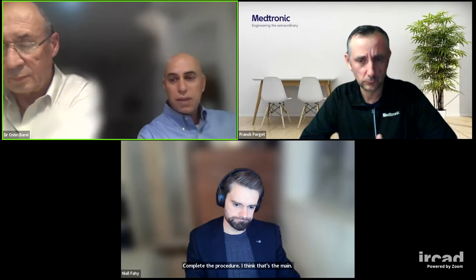And I can say that in hysteroscopy, if you want to take a look at the entire cavity, ten weeks is about right. When you go back with the scope and take a look, you can see the entire cavity. If you go a bit further than that, you might not be able to visualize the whole cavity. So it is possible to do it, but it will take a bit of change to the technique because you'll need to maybe divide the uterus into quadrants and go to different quadrants, make sure that everything is empty. You'll have to do it in a different way. Up to 10 weeks, you can still see the whole cavity as one, and you can assess for retained products after you complete the procedure. I think that's the main problem with a large uterus. Other than that, I don't see a lot of issues.